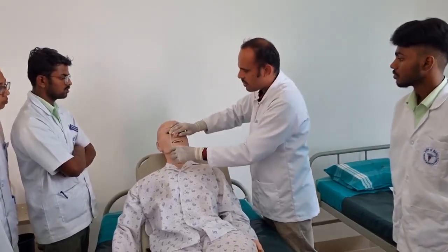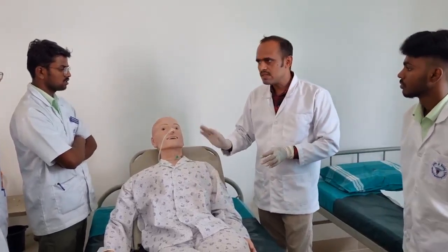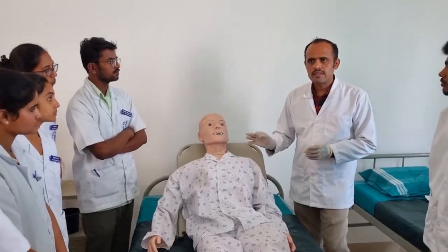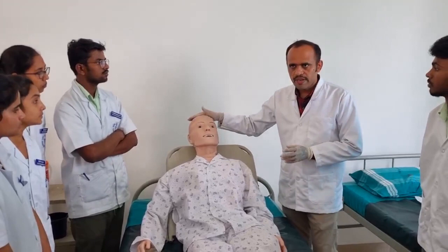So that is about NG tube insertion. This is regarding the procedure. At last, there is one important point regarding NG tube feeding.